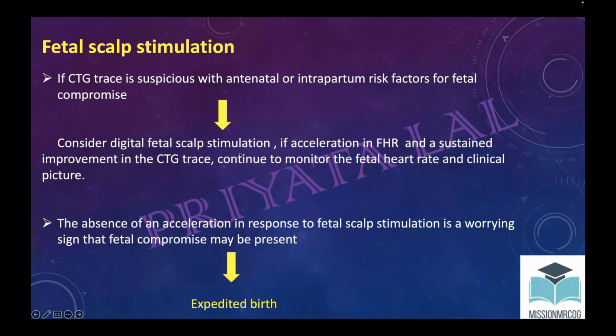After that you see the CTG. If there is an acceleration, then it is fine, continue monitoring. But if there is no acceleration, then there is a compromise. Please do expedition of birth.